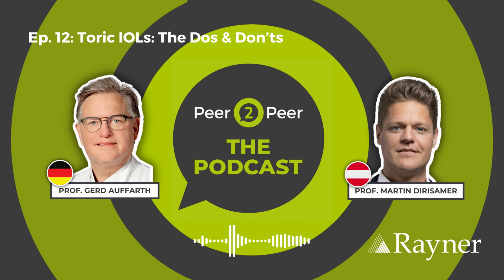Absolutely. And my approach is, the more complex the optics get, so multifocal, EDOF, whatever, the more residual astigmatism is the enemy number one. And I think this is why we should all go for toric when it really makes sense. Very good. I think that's a great last word and summarized everything very nicely.